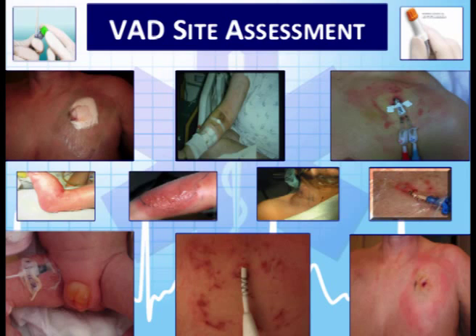What do you think about these? We had some problems, right? For gauze dressings, most facilities require that if there's gauze underneath the dressing, it has to be changed within 24 to 48 hours, versus other central lines, it's like a week.